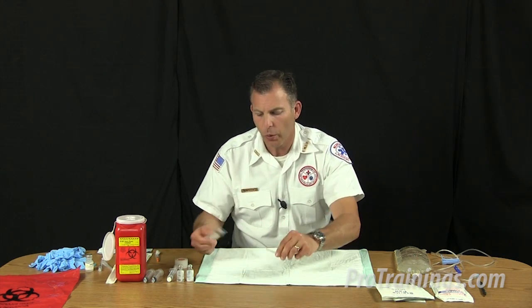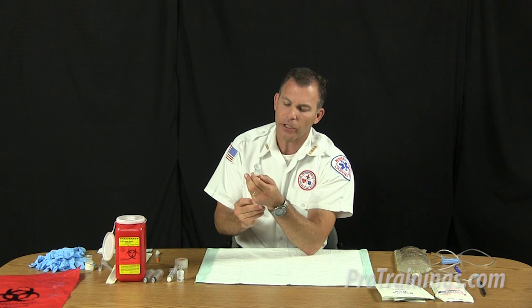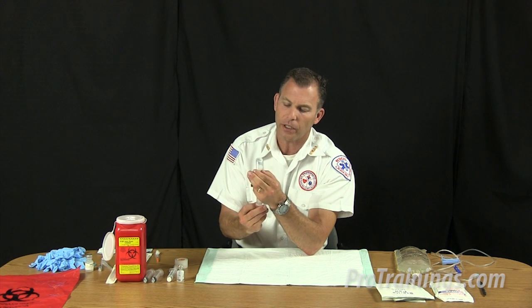Make sure not to bend, shear, break, or recap needles. If you must recap, use a one-handed method. For example, this is most often used when we are going to be drawing up medication. We need to obviously put air into the vial, rather, to get the medication out.